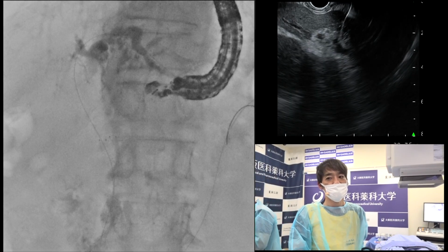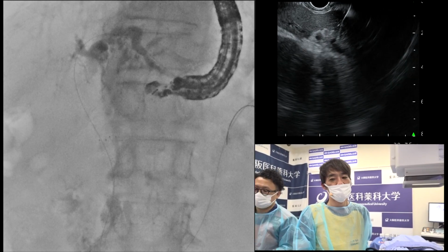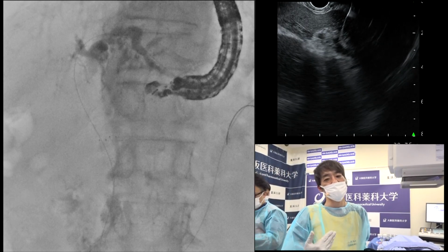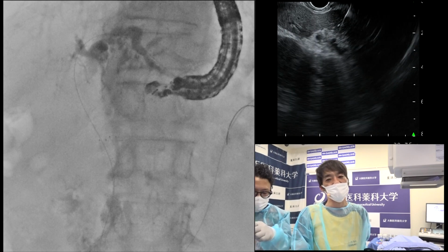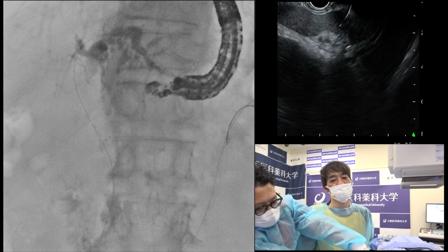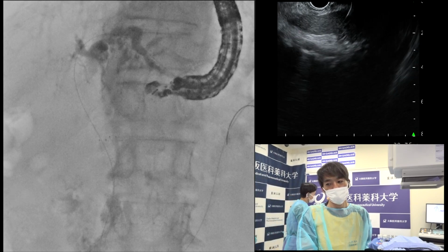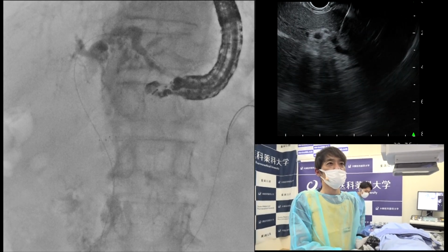So you are using a new stent, right? It's a special design stent, yes, an anti-migratory design in the stomach side, in the proximal side, called the spring stopper, right? The anti-migration spring stopper system is provided. It's produced in Japan. Can you show us the look of the stomach side of the stent? Do you have the box? Okay, go. That's the Toshi.